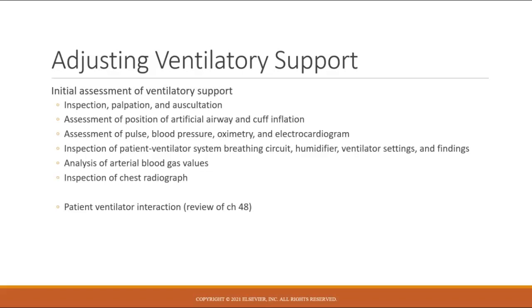on ventilation, or anytime you need to make a vent change, you should always be reassessing that patient completely. And that has a lot to do with the fact that what we know of lung mechanics, you make one vent change that can change other things and impact other things with the patient's breathing. So you want to make sure that you're looking your patient over, inspecting them. Your assessment can include inspection, palpation, or auscultation. Your assessments of your patients should always include an assessment of the artificial airway and cuff inflation.